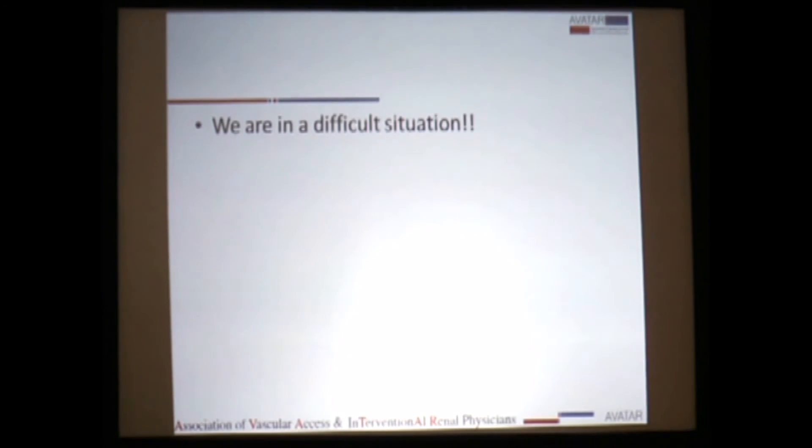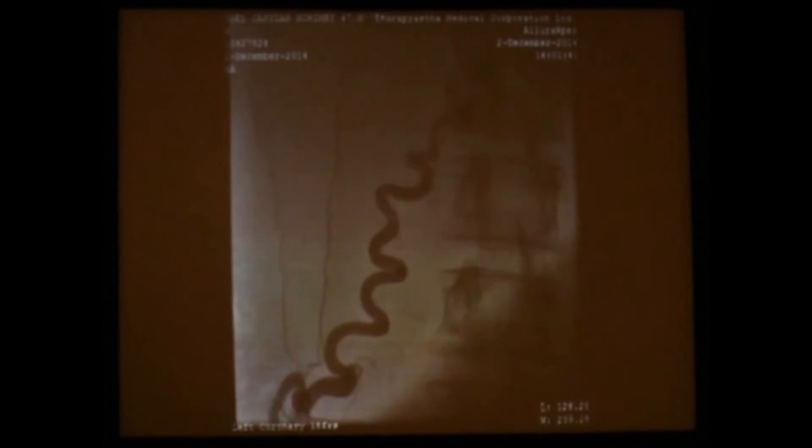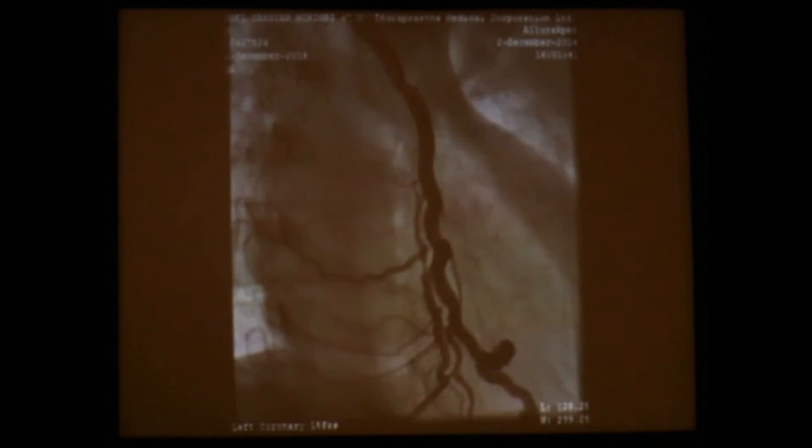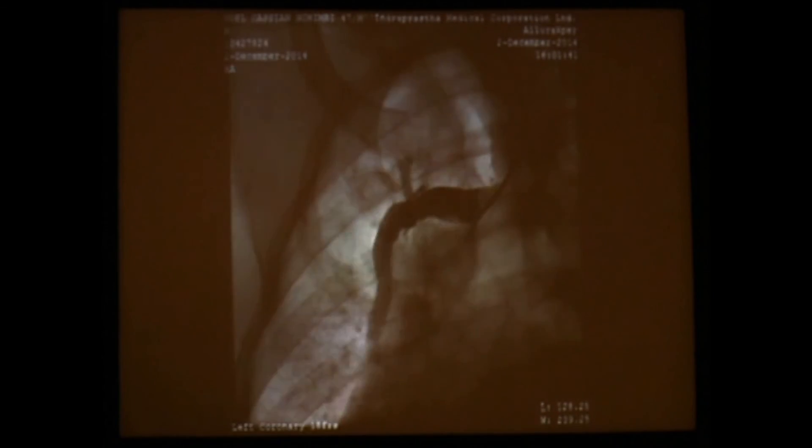We realized we were in a difficult situation and most likely had accessed a collateral. When contrast was instilled, we could see it going all the way down through the abdomen and returning through a collateral. This was confirmed by further scans and lateral views. The lateral view confirmed that this vein was actually outside the heart, going down and coming back again.